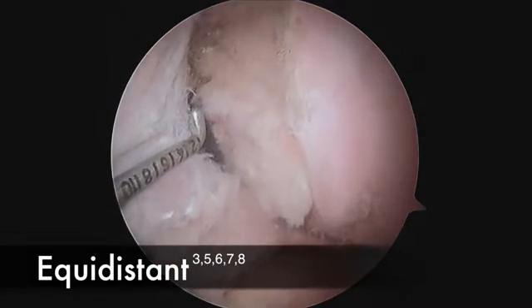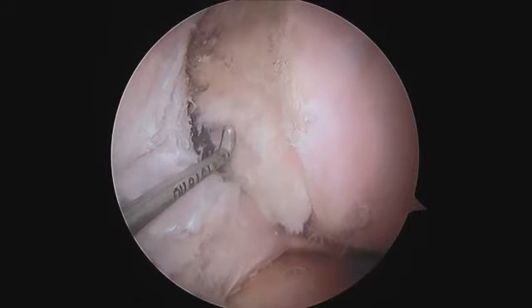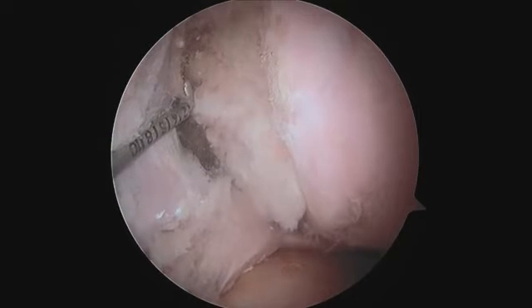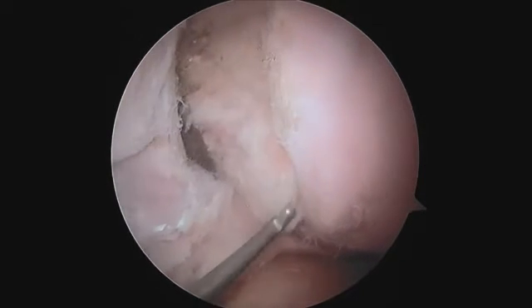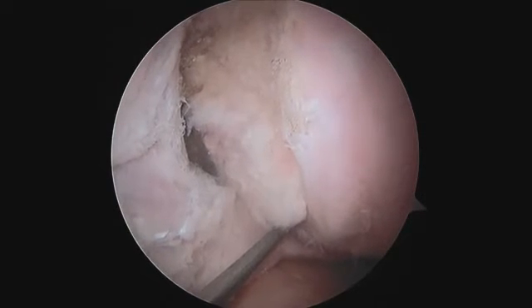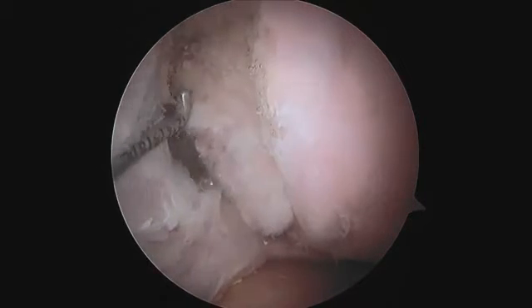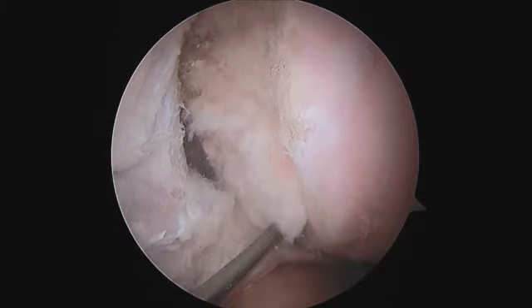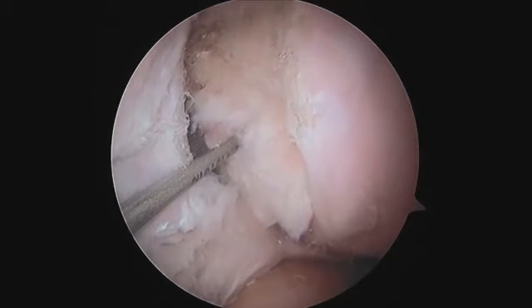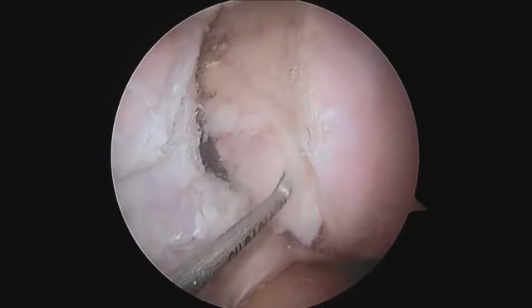The E also stands for equidistant. If you can't see the footprint anatomy, a simple way to find the ideal femoral tunnel position is to find a point that's equidistant between the top of the notch here and the bottom of the notch, adjacent to the posterior cartilage. If you take the point that's halfway between this top point in the notch and this bottom point here on the posterior femoral condyle, that point is somewhere here, right in our ideal position. So that's a good trick if you can't see the remnants of the femoral footprint.